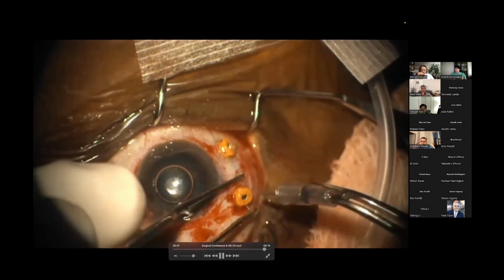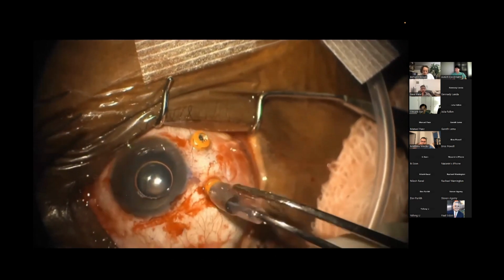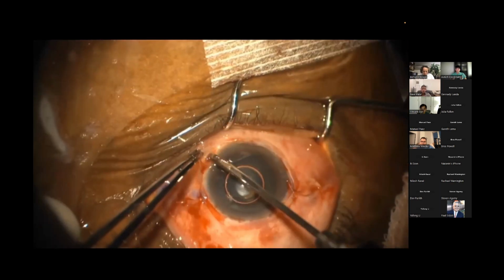And we use our infusion as a chimney to get out any air that remains in the posterior segment, rinse off to make sure there's no oil remaining, and close.